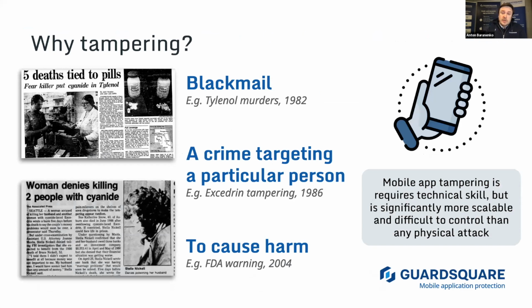So a little bit on the tampering, which in the medical world has a long history. Tampering can be done with malicious intent. There are plenty of examples of cases where medical device tampering was done in order to harm a group of patients or a specific patient. What's interesting is that sometimes it can be done even with good intent as well.